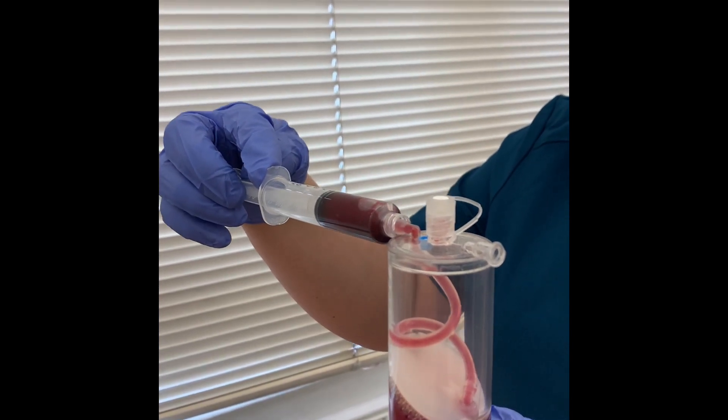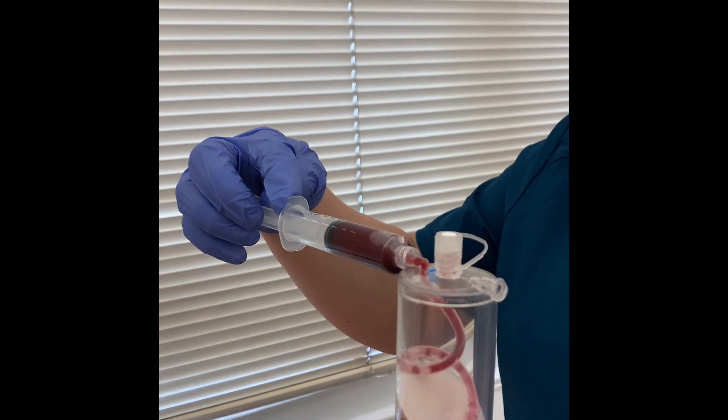It should get about 6ml or so, isn't it? Yeah, we've actually got a big yield. We've got 7. Oh, nice. Yeah.